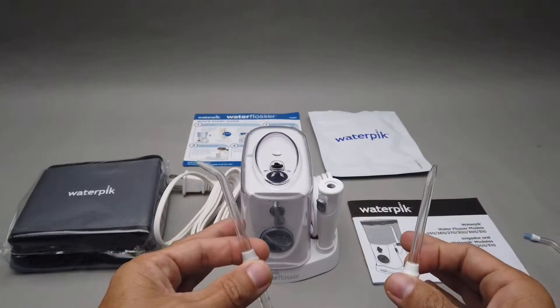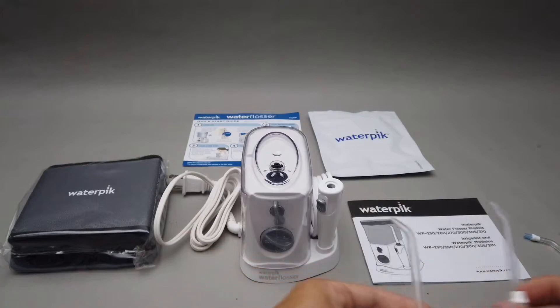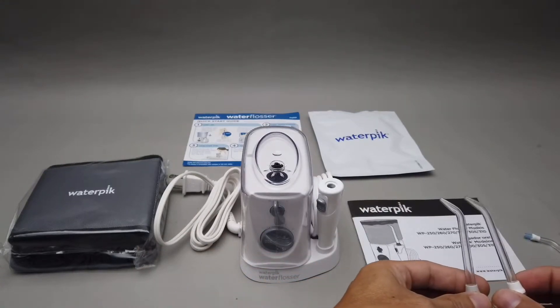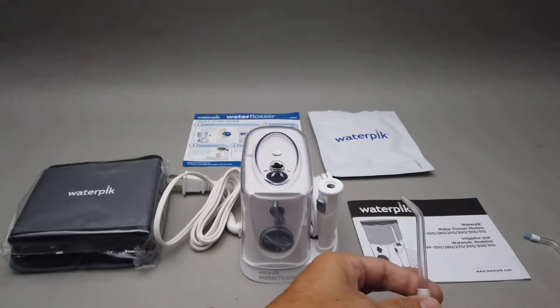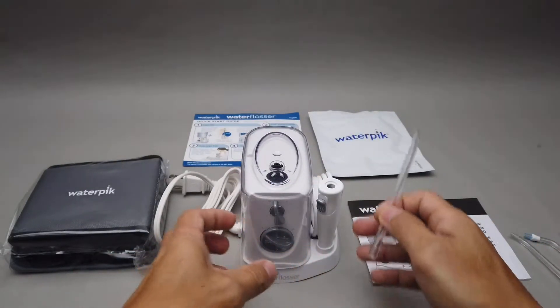If you're sharing this water flosser between two people, you only have six nozzles total, so not everyone can use all of them at the same time. But at least the two classic ones cover the basics.